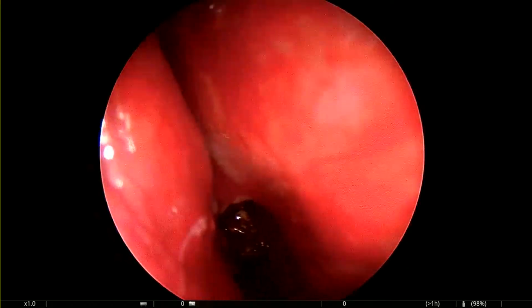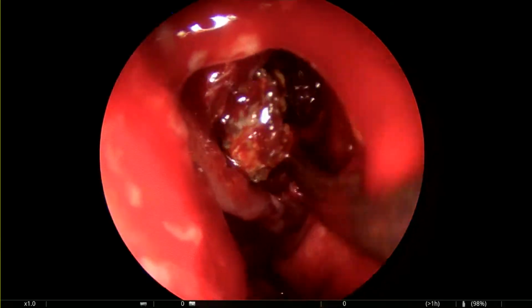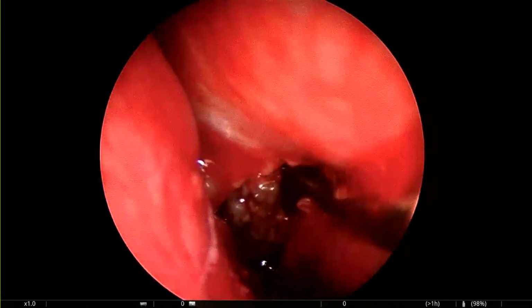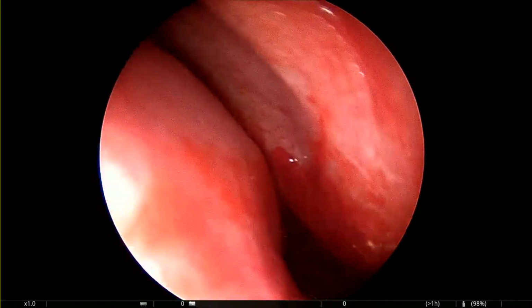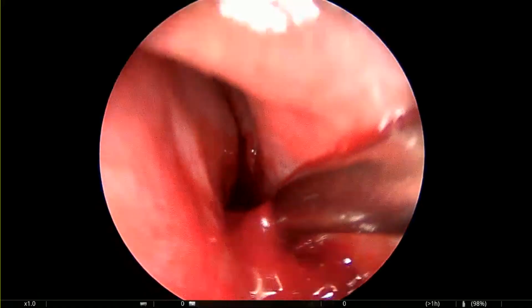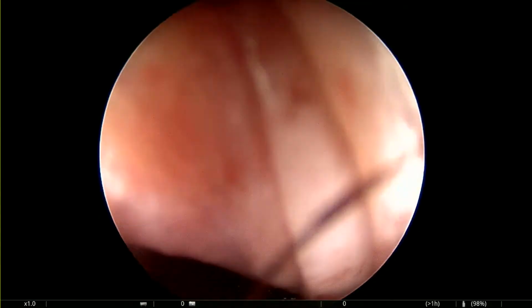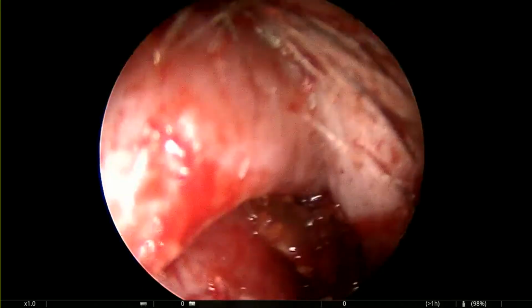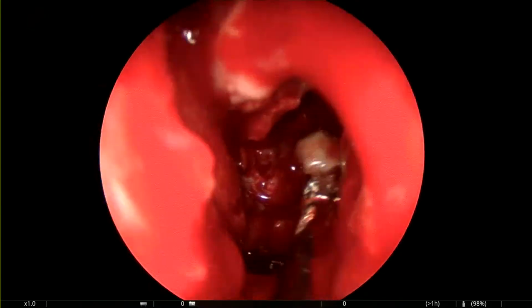Like that. Okay. And with the suction tube, you are able to extract and catch, because it's friable, of course. Yes, je passe derrière, and with like a hook, with my suction tube. Like that. Okay. So for the mycology and histologic sample. So another part.